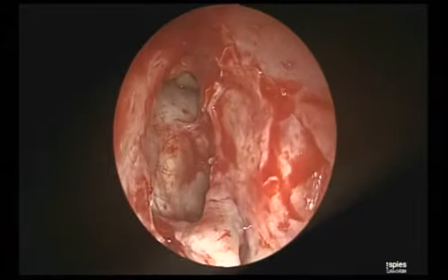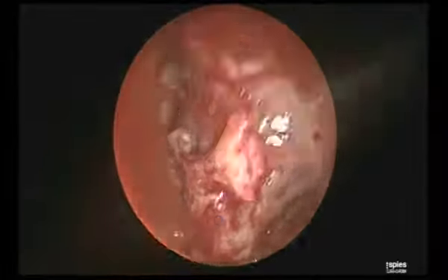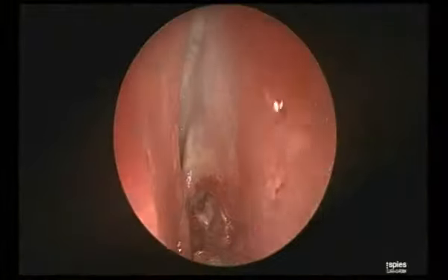Beautiful. So if your bulla is preserved and you work anterior to it, you cannot damage the anterior ethmoidal artery. It is beautifully seen. Thank you very much.